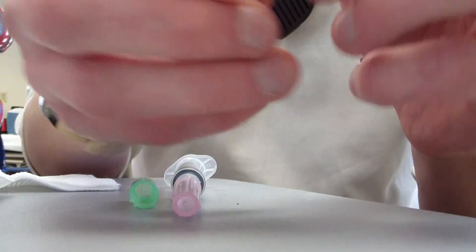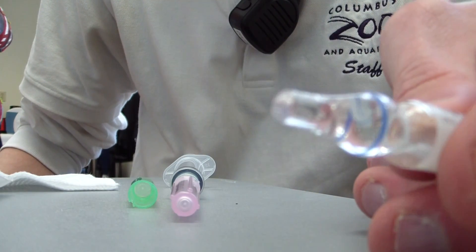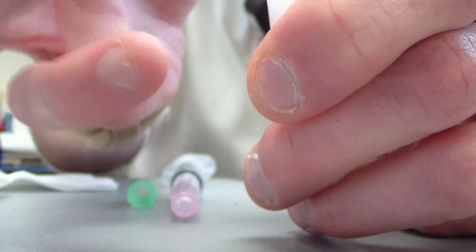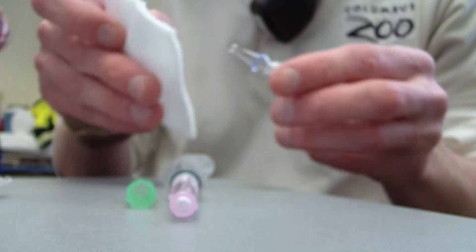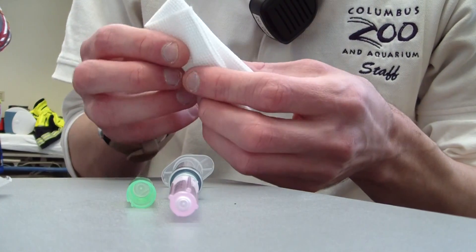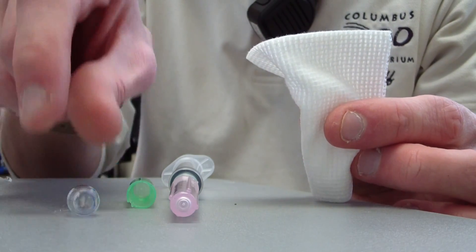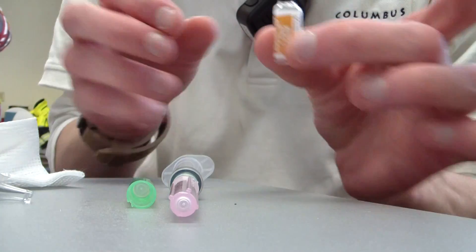Normally it looks like that with the fluid actually in the top of it. What we're going to want to do is flick it to get the fluid out from the top so there's nothing on the top. Then we're going to put it kind of like a little blanket right here and crack just like this. This will then go into the sharps, and we have the top just like that.